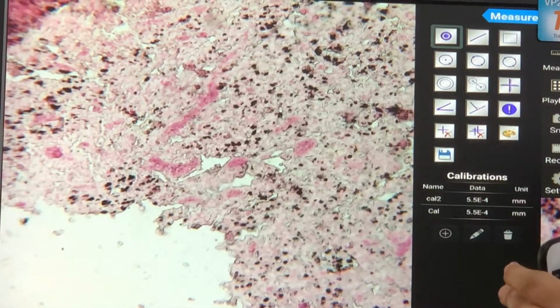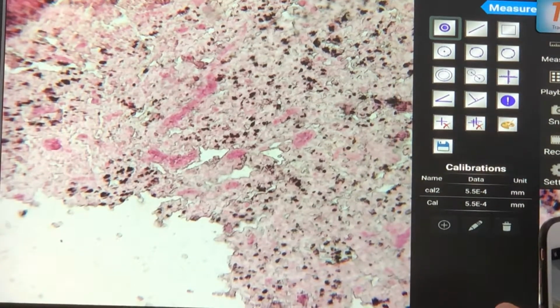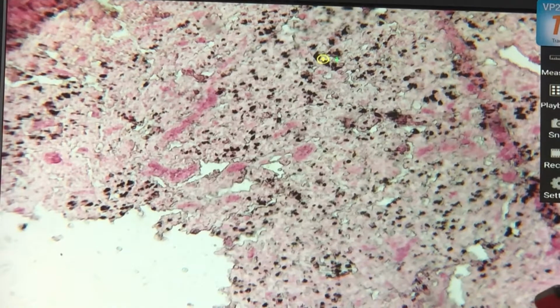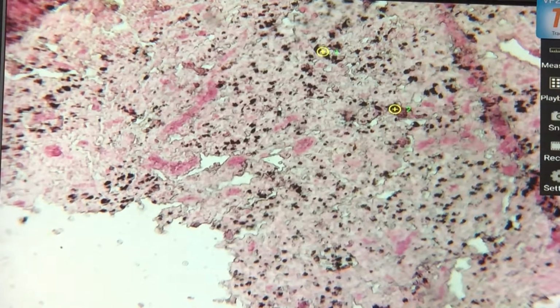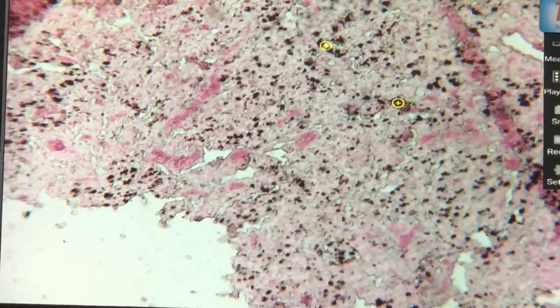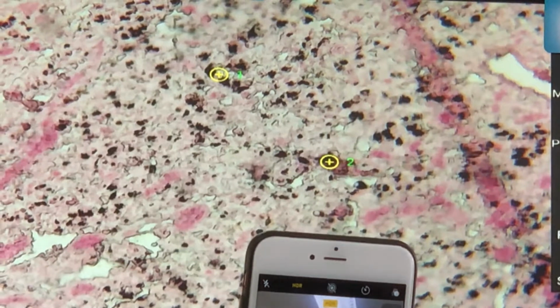special in the most, because what you see there, as you can compare, are these numerous black dirty dots. Those blackish areas or structures. What are they? Identify the pathologic process at the tip of pointer 2. What is that? Dystrophic calcification.